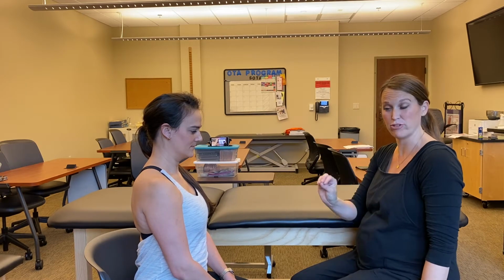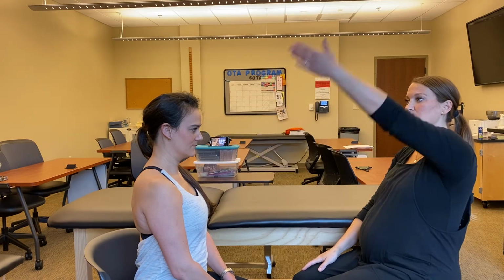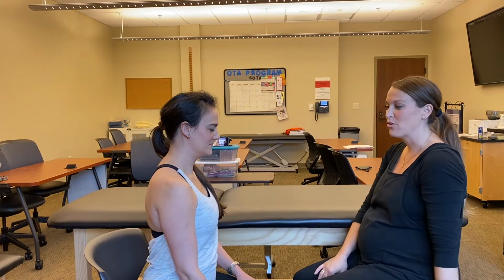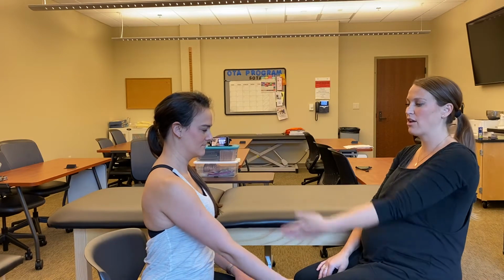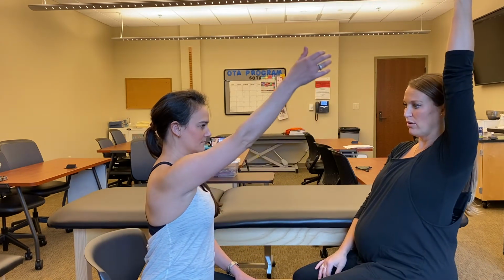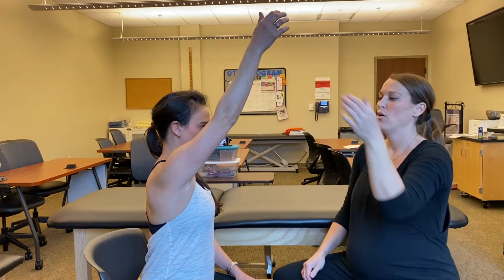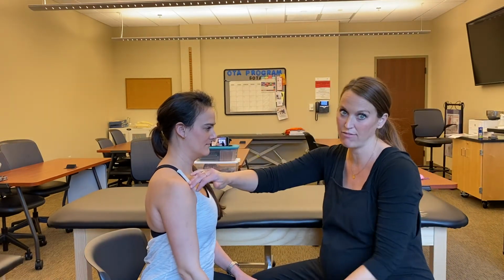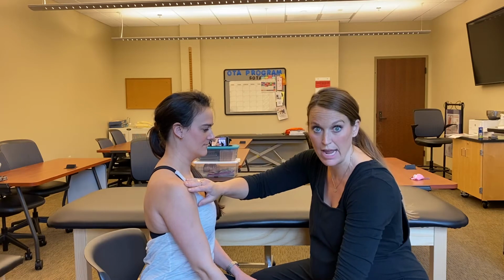So when I first see the patient, I wanna see what they can do on their own. So that's your active range of motion. So I'm gonna say, this is the movement that we're doing here. I'm not gonna talk to Courtney and say, do shoulder flexion, because she doesn't know what that means, okay? So can you just point your thumb to the ceiling and go up as high as you can go?